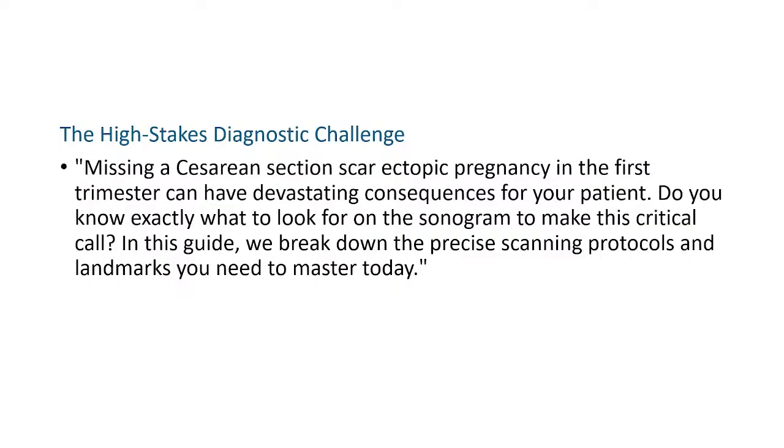So do you know exactly what to look for when you're doing an ultrasound scan to make this critical call? In this guide, we break down the precise scanning protocols and landmarks you need to master before you can say that you're competent in screening for cesarean scar ectopic pregnancies. Some of you are already competent, and I wouldn't take the credit away from you, but for educational purposes, some of you are not yet competent, and refreshing and adding pieces of knowledge is always critical and vital.